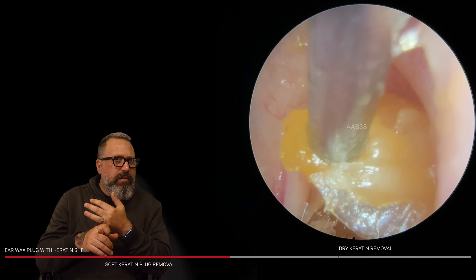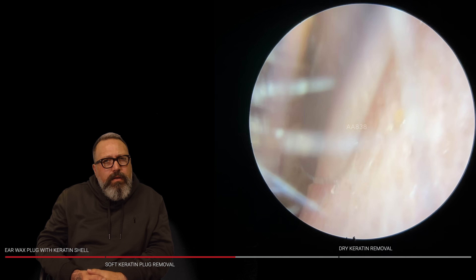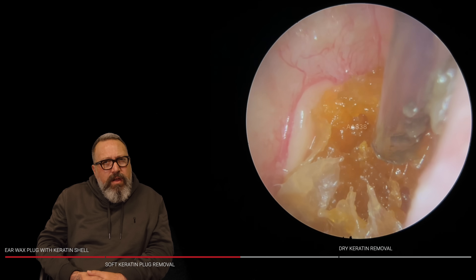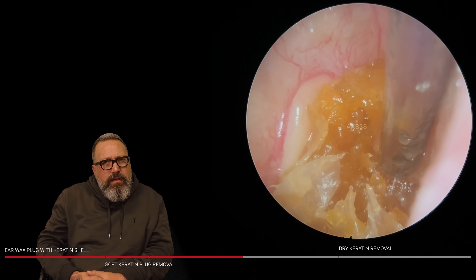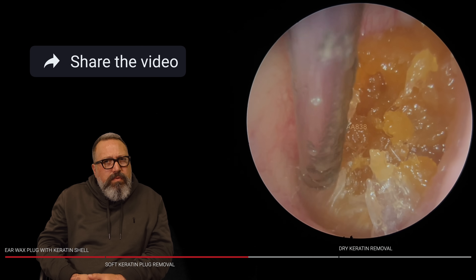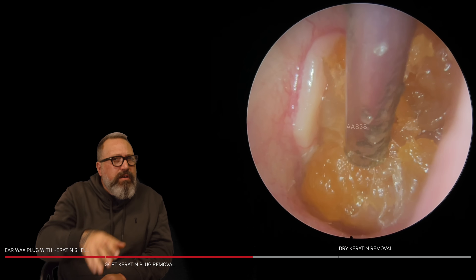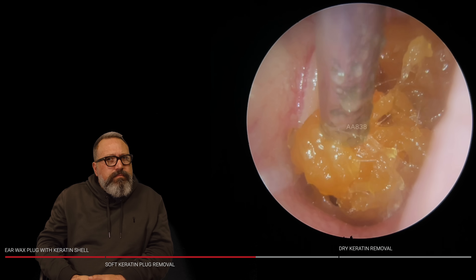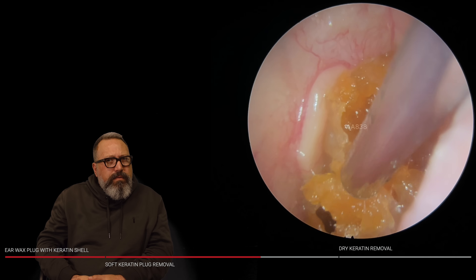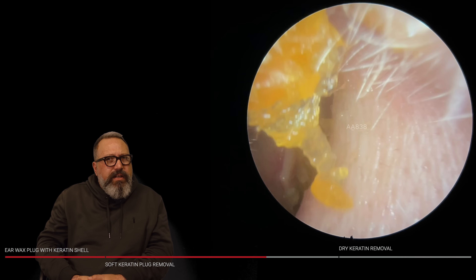Let's have a little look. This is really thick old stuff — really, really thick old stuff. I'd be intrigued to see what this eardrum looks like now. I'm being very gentle here, just trying to hover over this skin and wax. That looks like a good bit of movement there — keep an eye on that section, the whole section looks like it's going to go. It's definitely coming away. My goodness, there's more behind it as well. This was a really sticky old piece of wax.